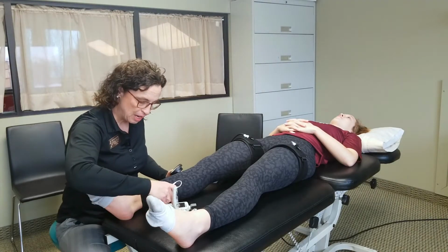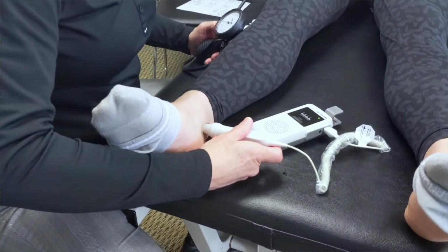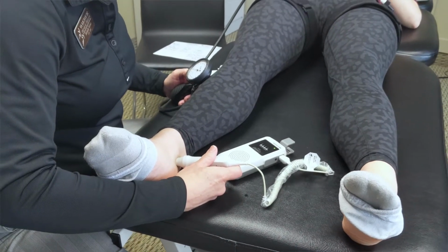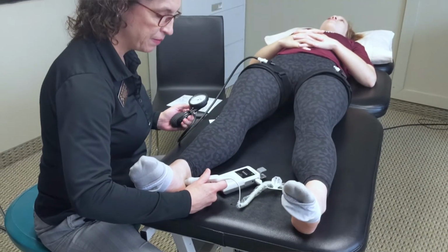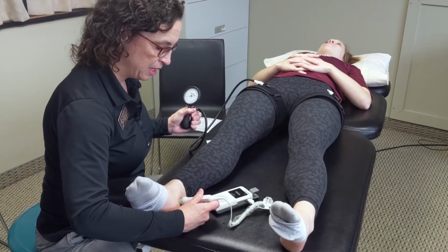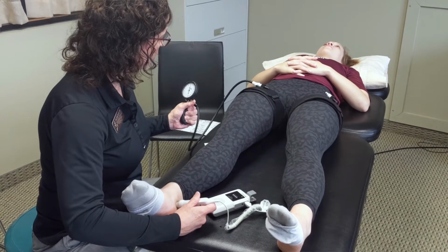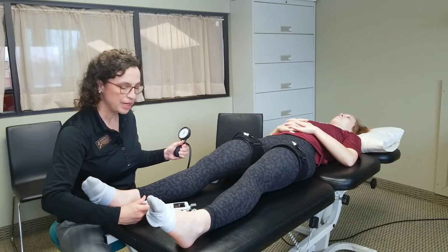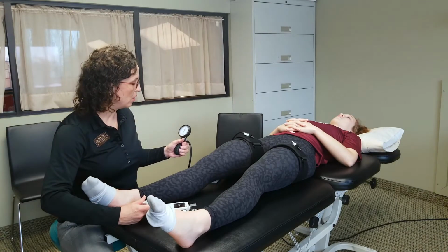All right, so I've got a Doppler here and I'm going to find her heartbeat. There it is. And now I'm going to pump up the cuff around her right leg until that goes away. So that whoosh whoosh will go away. And that's at 140. So her 100% occlusion pressure is 140.